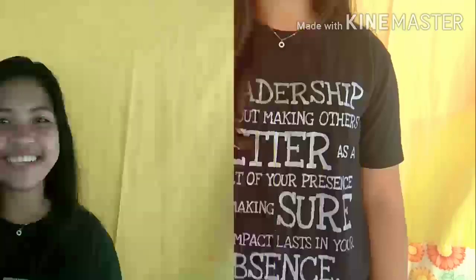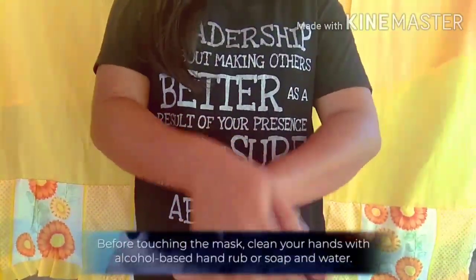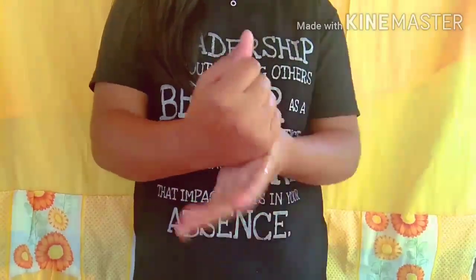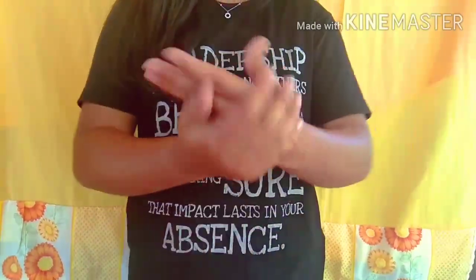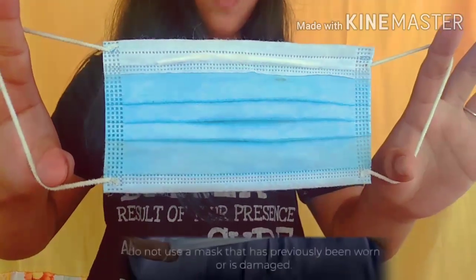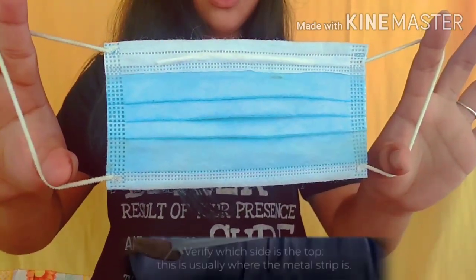How to use a medical mask? Before touching the mask, clean your hands with alcohol-based hand rub or soap and water. Inspect the mask for tears or holes. Do not use a mask that has previously been worn or is damaged.